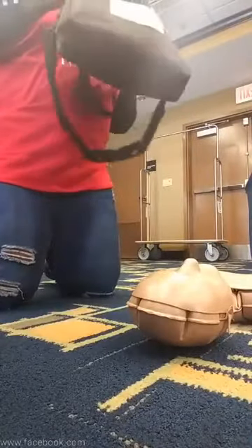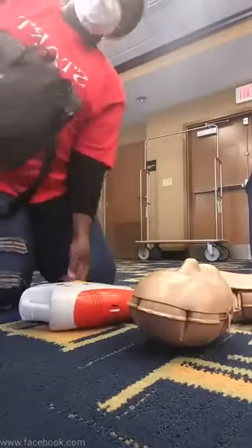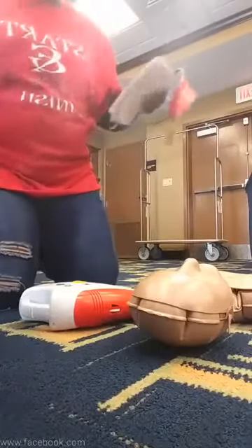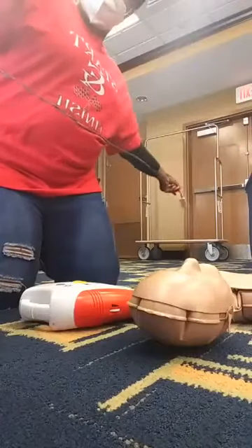Okay, the AED is an automatic external defibrillator. What it does, it detects an abnormal rhythm, and when a shock is delivered, it tries to restore the rhythm of the heart. It tries to get the heart back to beating again. It restores the heart's cardiac rhythm.